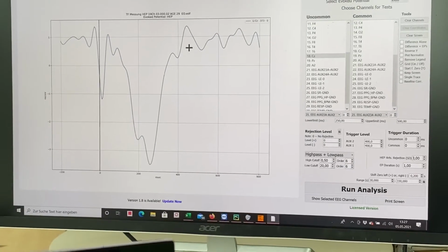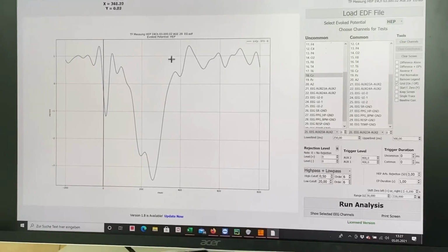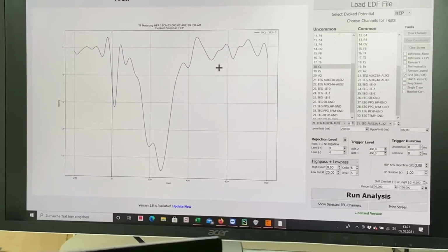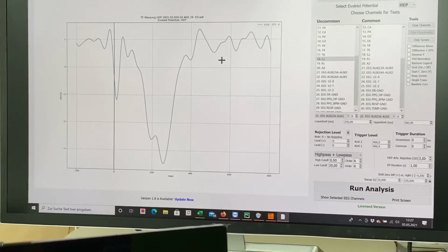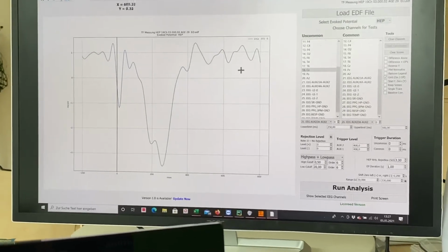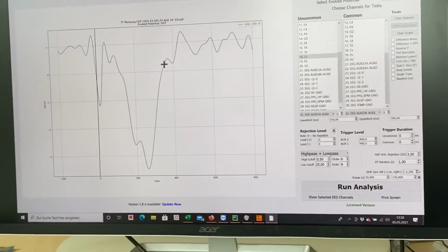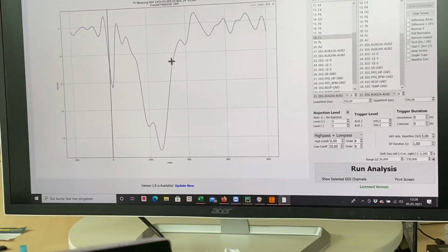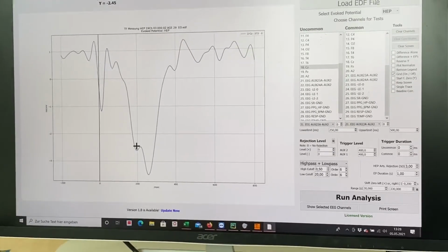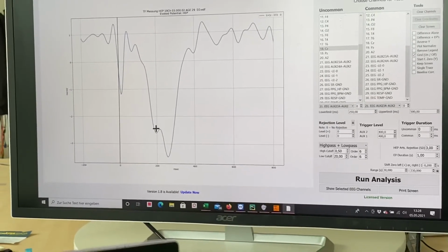And then we have an event-related potential called HEP, which is heart-evoked potential, which is about here, because the R wave and this deep deflection can be due to the T wave or can be due to the volume conduction when the heart wave arrives in the brain.